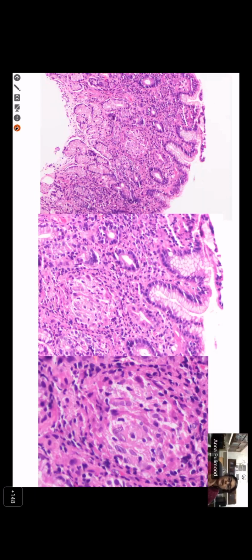What about a lymphoid cuff? That will be evident in TB, tuberculosis. It is more common in TB than in Crohn's disease. Yes, ma'am. Okay, what about fibrosis? Fibrosis is more common in TB than in Crohn's. But one thing is, in the mucosa, granulomas usually don't have fibrosis.